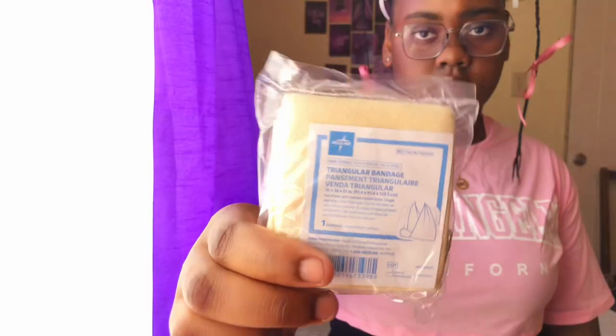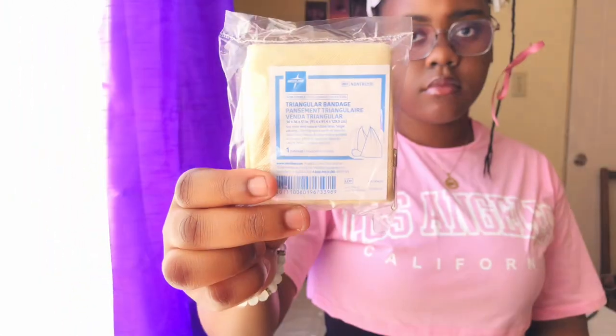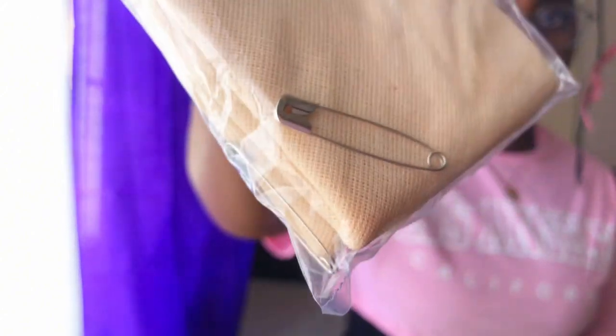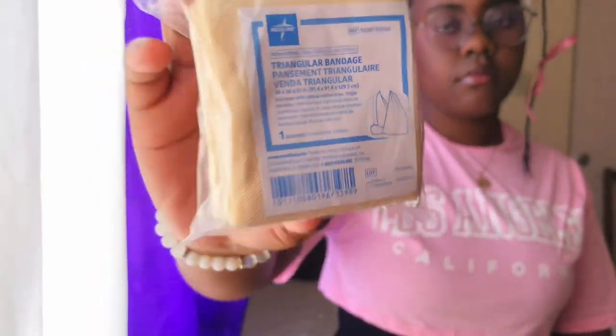The next item is the triangular bandage. The triangular bandage is used as an arm sling or as a pad to reduce bleeding. As you can see, there are also safety pins included — the safety pins are used to secure bandages and slings, just like with the triangular bandage.